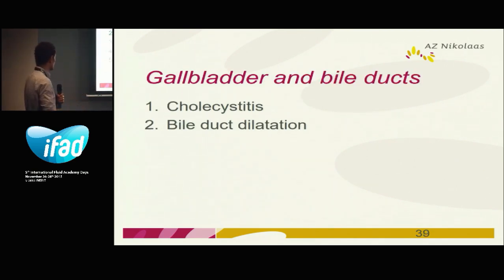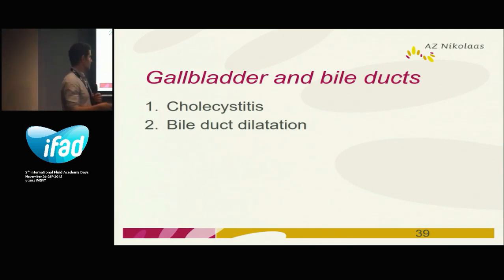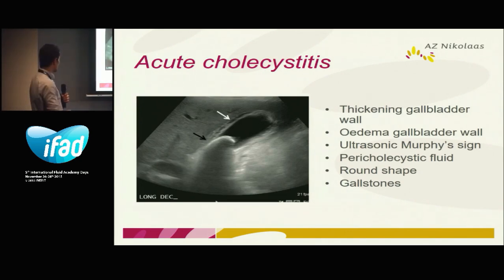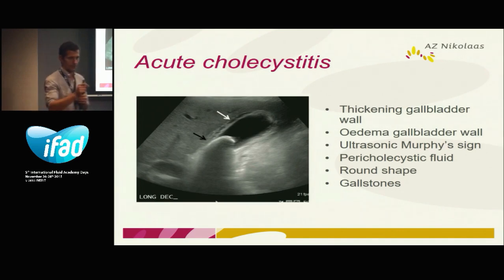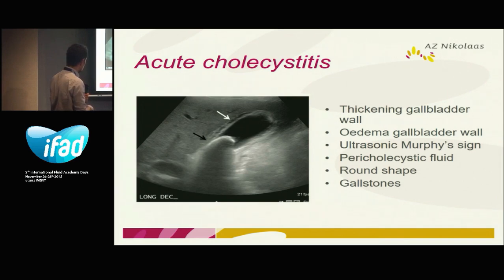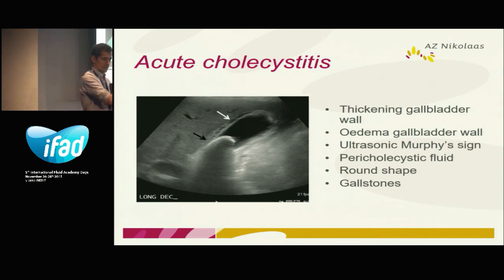Two very important things you can easily appreciate with ultrasound: cholecystitis and bile duct dilatation — very important for the ICU. In cholecystitis, this is the gallbladder, here we see a stone, and this is the gallbladder wall. Normally the wall is very thin and barely visible. Here we see between the liver and gallbladder a thickened multiple-layered wall with hyper- and hypoechoic layers — this edema in the gallbladder wall is very diagnostic for cholecystitis.